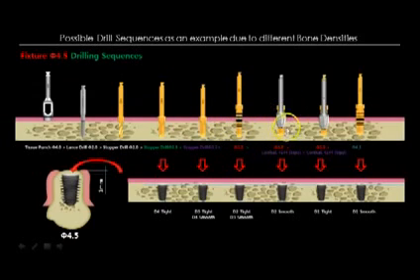And here's another one with your 3.8 and your cortical bone drill. This is D2 smooth, 3.8 drill, and your cortical bone drill again. However, your cortical bone drill all the way down, because this one was halfway down. This cortical bone drill was all the way down. Because remember, there's two measurements in your cortical bone drill. There's two widths.